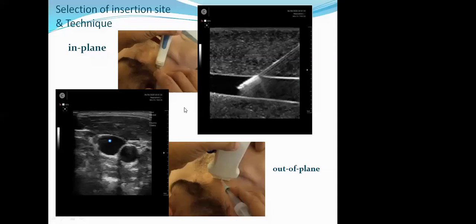Once you select your puncture site, there are two techniques. One is to perform the puncture while keeping the probe in the longitudinal direction, where you can see the longitudinal plane of the vessel. This is called the in-plane technique. Look over here, I keep the needle right in the center of the marker at a 45-degree angle.